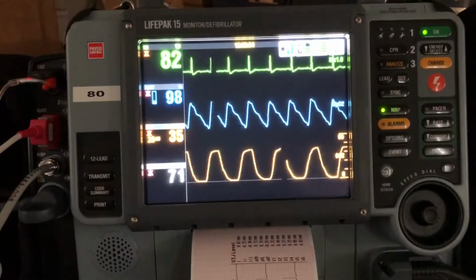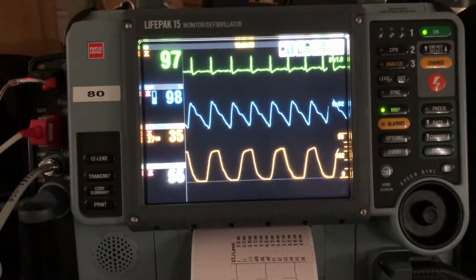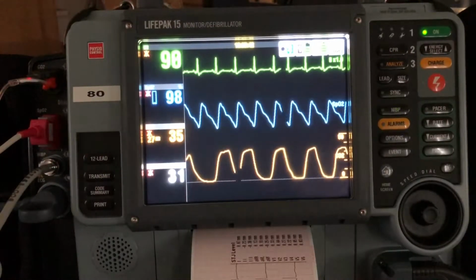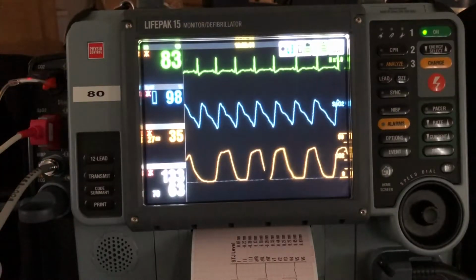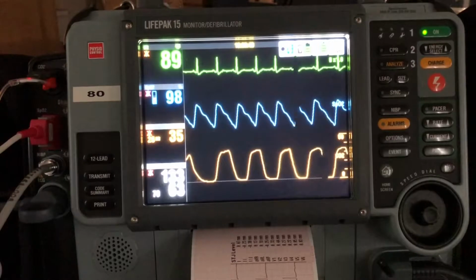Okay, in this video we're going to talk about the Lifepack integration with EMS charts for ALS providers. So as you can see, we have a patient hooked up right now. They are on a 4 lead. We just completed a 12 lead. They are on SpO2 as well as ETCO2 and the blood pressure cuff.